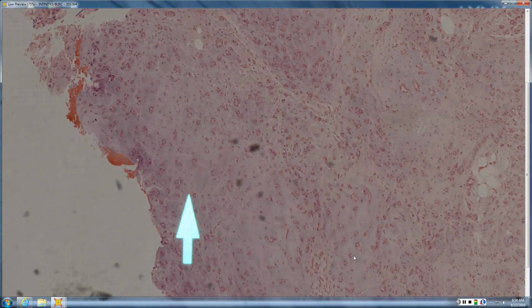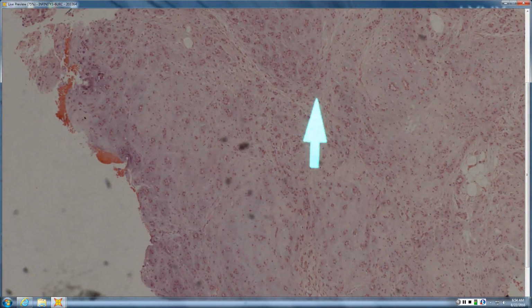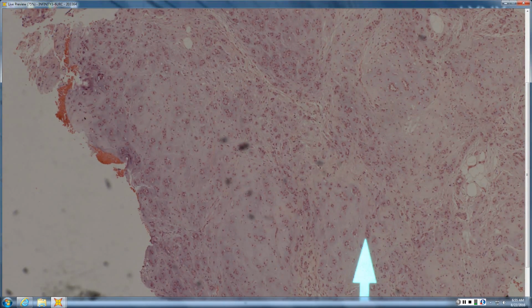You can certainly just get cutaneous deposits of cartilage, various things can do that. There's chondromas and whatnot. But in this case, it is essentially a biphasic tumor. What makes this a mixed tumor is that you have a syringomatous or sweat gland proliferation, but then you also have a mesenchymal component, and that mesenchymal component is cartilage or even bone or fibrous components. Since you have both of those things, that's why it's a mixed tumor. The other name for this is chondroid syringoma.